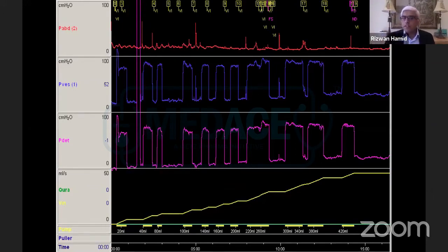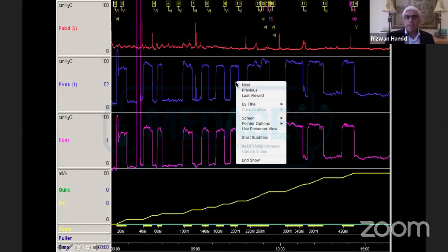So in this patient, you can see there is a loss of compliance developing. So you want to be proactive. Taking medications has not worked. You might consider injecting botulinum toxin, because what you want is the resting pressures to come down so that the filling pressures are down and the upper tracts are not under any pressure. It's a classical, pattern recognition, classical trace done with the catheter.